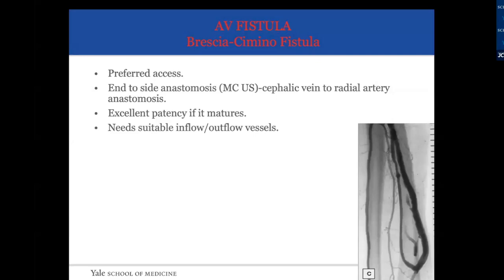So currently in our institution, what we tend to get more is those peritoneal dialysis catheters to be placed first. And then those patients will last probably around 2 or 3 years with those peritoneal dialysis catheters before they actually start on hemodialysis. And that will actually increase the possibility of the patient having more years on some sort of dialysis.